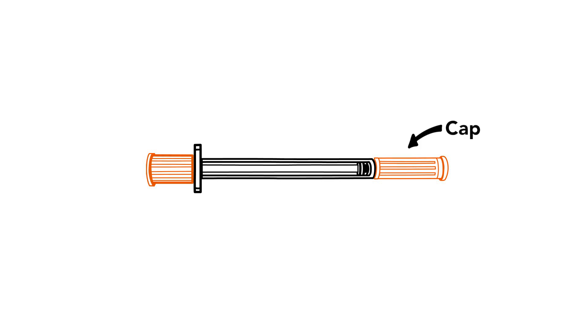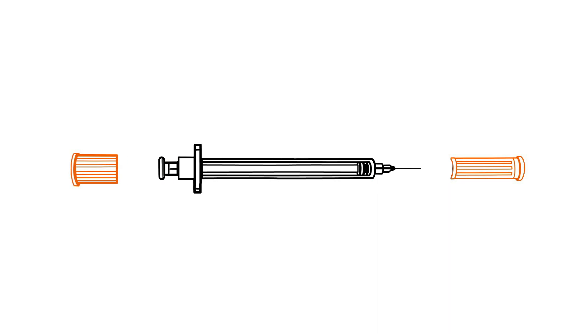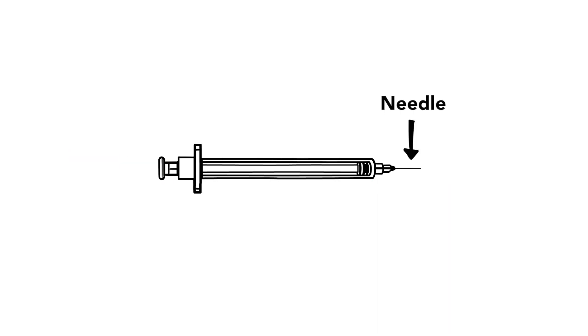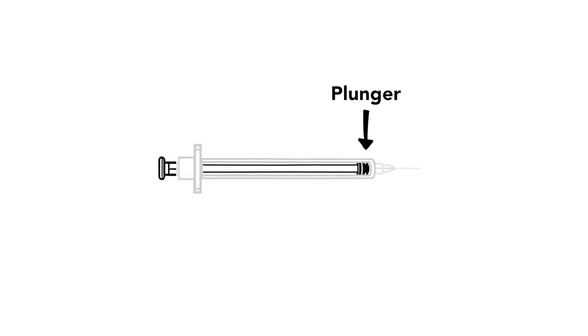The orange cap protects the needle until we are ready to use the syringe. There is also a cap on the plunger side. The needle is the part that goes under the skin. The barrel measures the insulin dose. An insulin syringe will have lines showing insulin units. The plunger moves insulin in and out of the syringe.